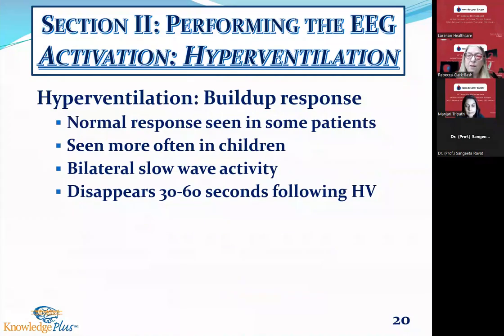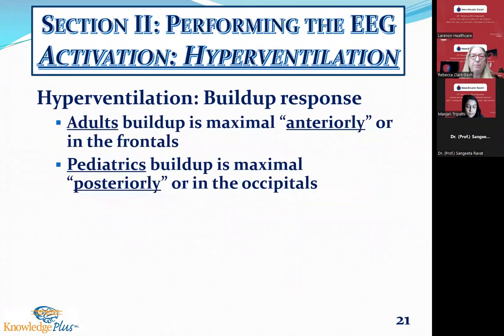The normal response to hyperventilation is called a buildup response. So it's normal if it's present, it's normal if it is absent. It doesn't matter if it's there, it's okay. If it's not there, it's okay. It's most often seen in children. It's bilateral slow wave activity, has no sharps, no spikes to it. And it disappears at about a minute. You shouldn't have any more sign of buildup.